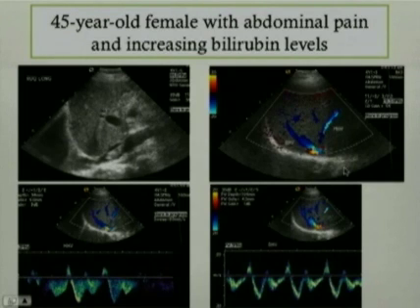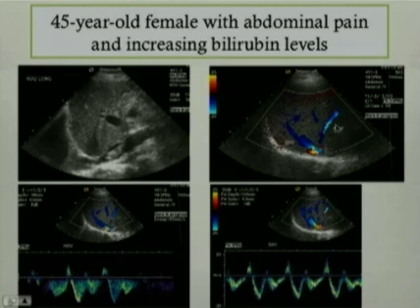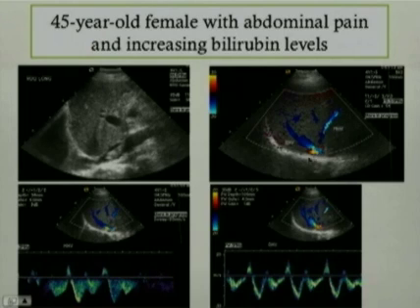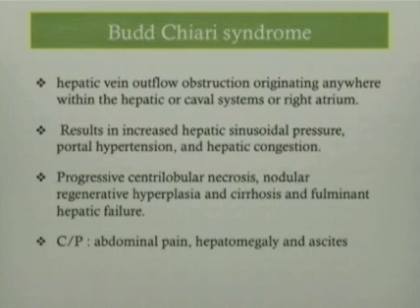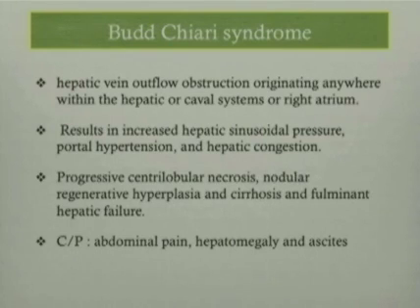The last case is a 45-year-old female who presented with abdominal pain and increasing bilirubin levels. The first image demonstrates the IVC with an echogenic material within it representing thrombus. The other pictures demonstrate the right hepatic and middle hepatic veins, although the left hepatic vein was not seen. Also seen is an area of aliasing or mosaic artifact corresponding to the presence of thrombus within the IVC. The diagnosis was Budd-Chiari syndrome, which is hepatic vein outflow obstruction originating anywhere within the hepatic or caval systems or even the right atrium. It results in increased hepatic sinusoidal pressure, portal hypertension, hepatic congestion, progressive central lobular necrosis, nodular regenerative hyperplasia, and cirrhosis, and can lead to fulminant hepatic failure. Patients present with abdominal pain, hepatomegaly, and ascites, and need emergent TIPS to relieve the pressure.